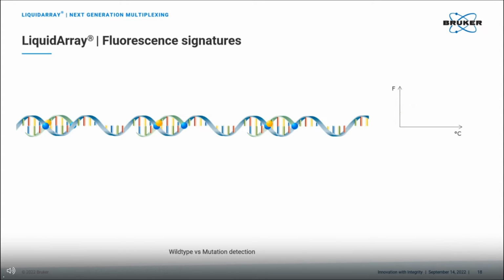So here we have a target strand of single-stranded DNA, and showing here the lights on and lights off probes that have bound to that.